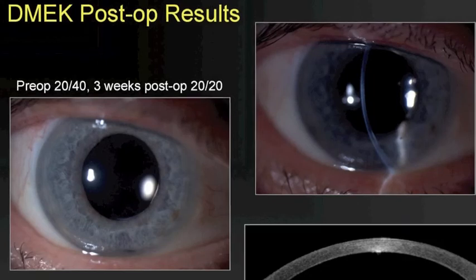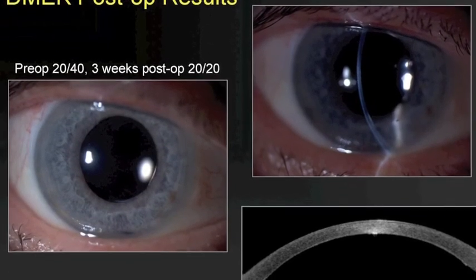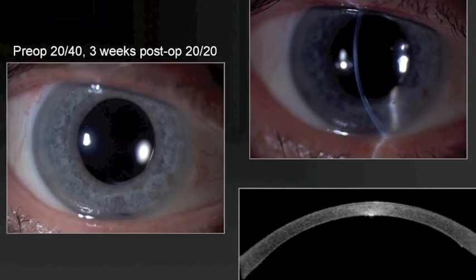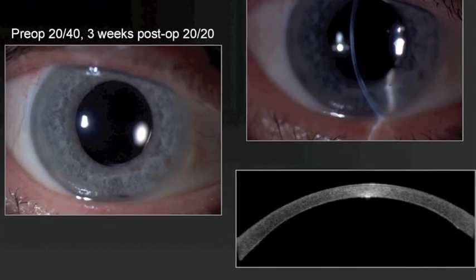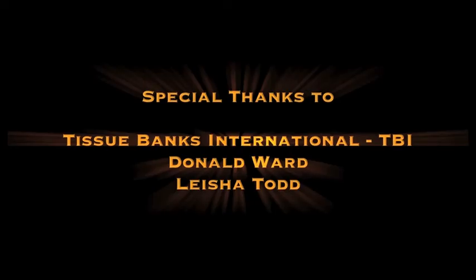Our early results support the advantages of DMEK, and we hope that our simple device, which is available in every operating room, will make it easier for willing corneal surgeons to transition to this new procedure.